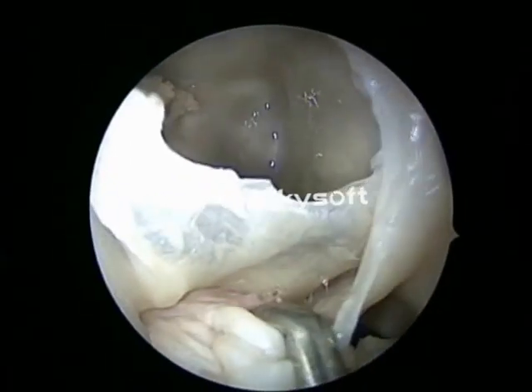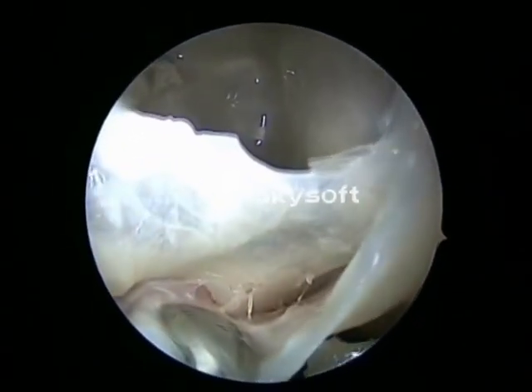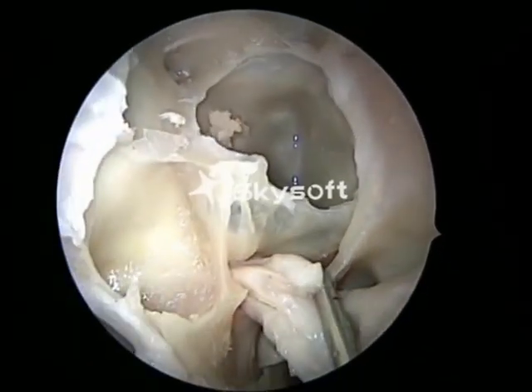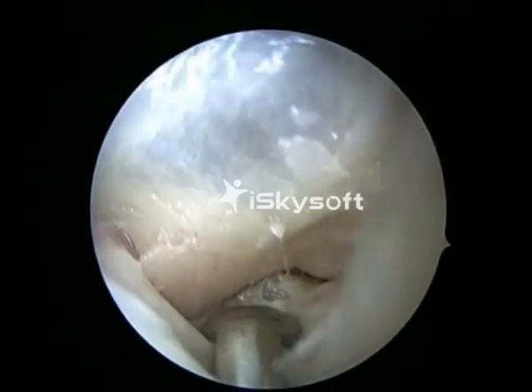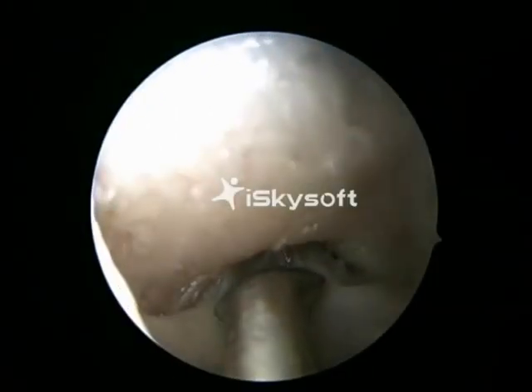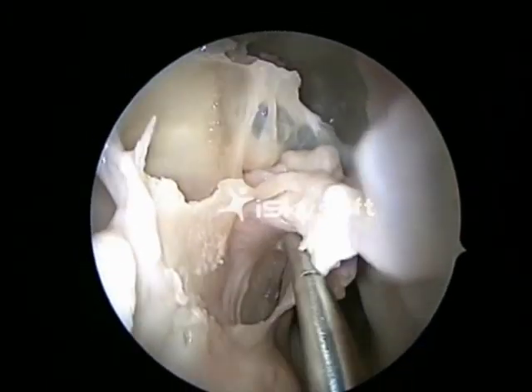Dissection posteriorly will now expose the palatovaginal canal, which is along the floor and anterior wall of the sphenoid sinus, which transmits the pharyngeal nerve. It's inferomedial, and supralaterally will be the Vidian canal. That's the Vidian canal over your picture.